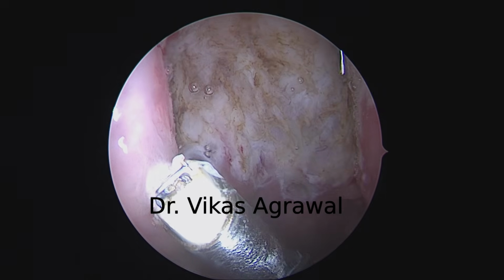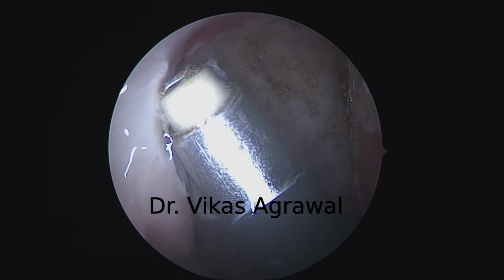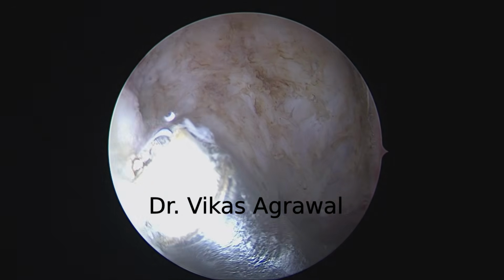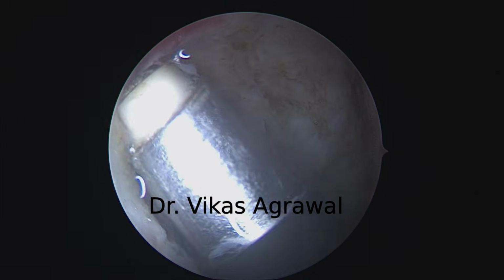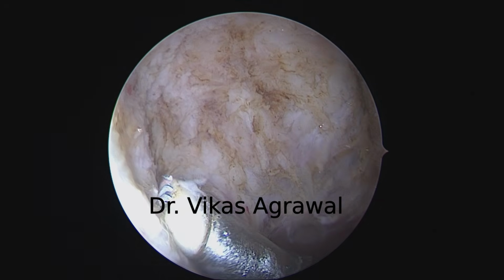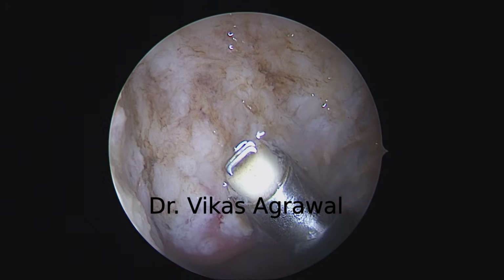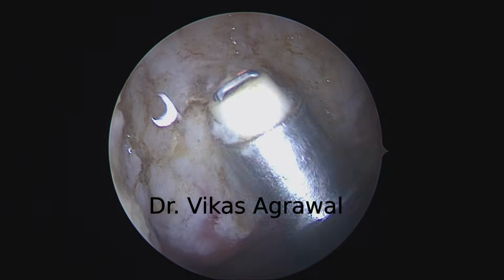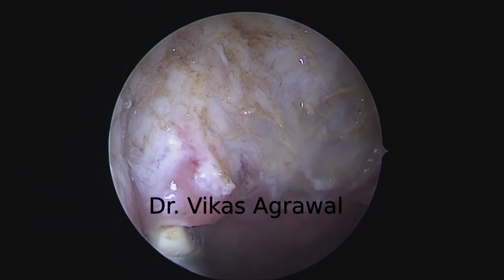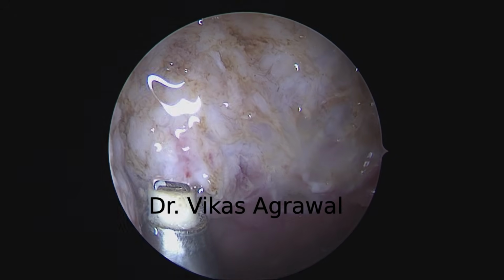However, there's a little bit of lymphoid tissue which I am removing and following this trajectory behind to the fossa of Rosenmuller. And there's a lot of tissue here which I need to remove.